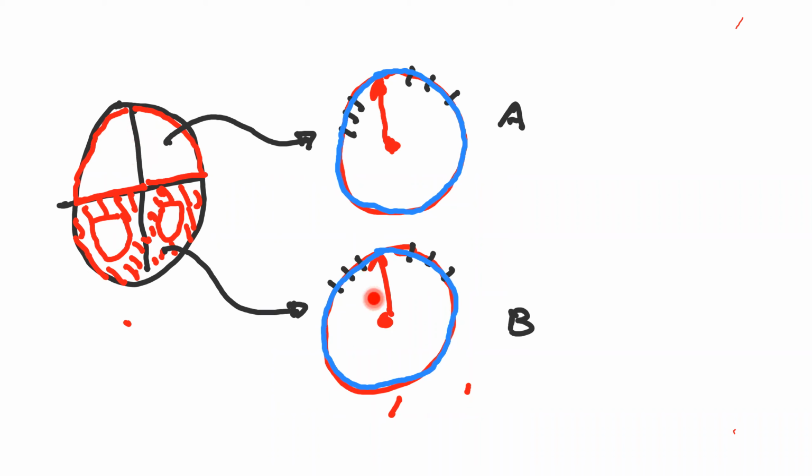In the ventricular, the depolarization happens quickly. That means needle fluctuation goes to 20 quickly and comes back. Right? Go to 20 quickly and come back. In here, go to 10 slowly, then come back. Here, go fast, and here come back. So, did you get the idea of this? Yes. This is very important.